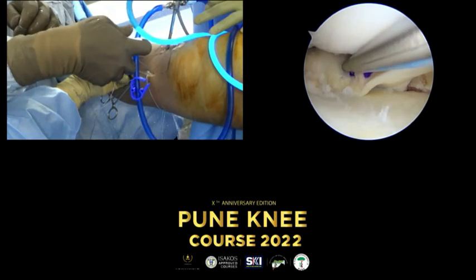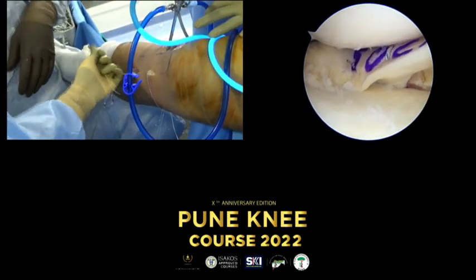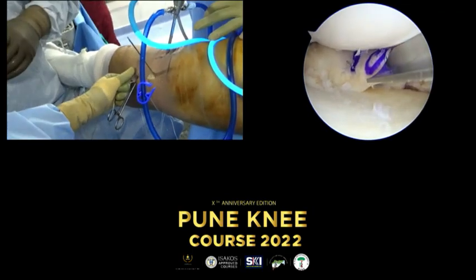Oh, it breaks. It broke. Another one. The next. Probably I pierced the meniscus too close to each other. I will do it more generously now.